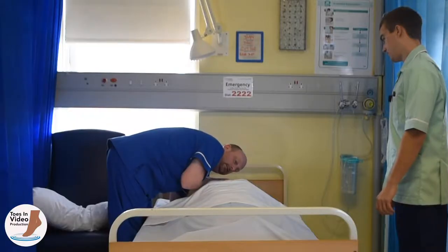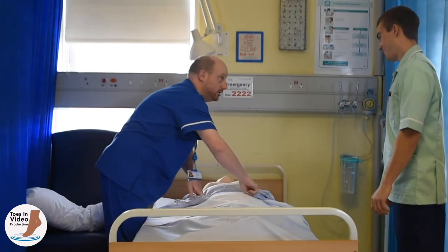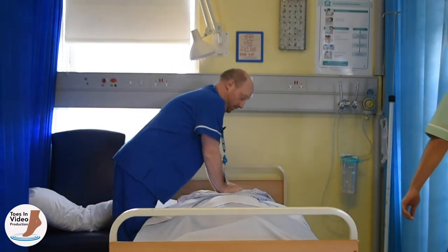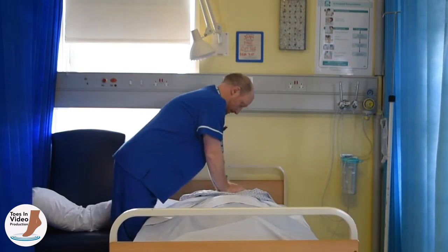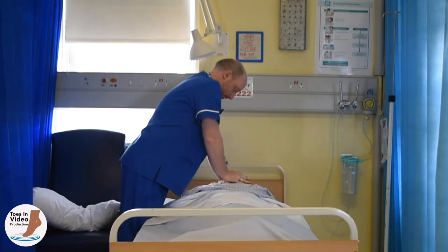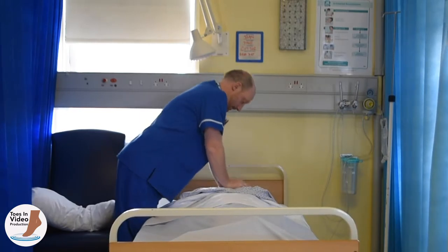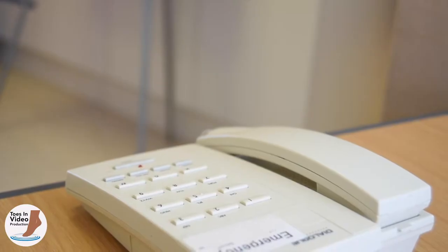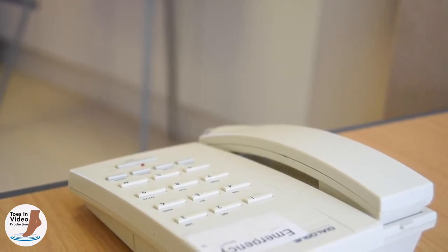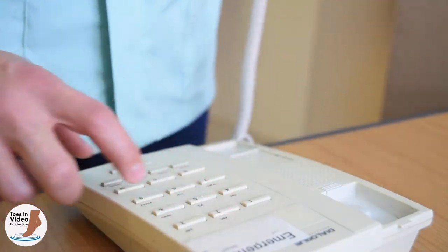If you have attracted assistance and are in hospital buildings on the St Mary's site dealing with an adult patient in cardiac arrest, send the other person to make an emergency call to summon more help and instruct them to bring back the resuscitation equipment including the nearest defibrillator. This will be a 2222 cardiac arrest call to switchboard. Ensure that the location is relayed clearly and with as much detail as possible.